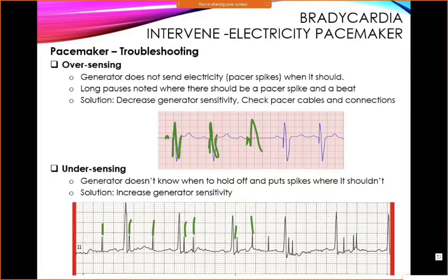So anyway, again, don't spend a lot of time on this. It's an advanced concept. I just need you to know that pacemakers are the treatment for bradycardias. The electrodes are placed into either the atrium or the ventricle or both, and that the physician orders the mode, the rate, and the electricity, and we, the nurse, manages the sensing of the pacemaker.